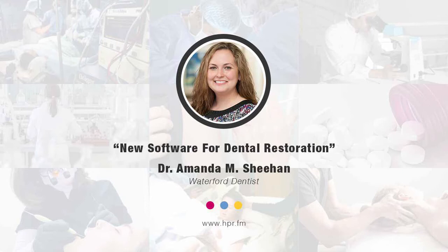Sure, there was a lot of blind faith before. Is this something that's absolutely, positively accurate as far as how it's going to look? So the best part about computers is you can copy and paste. So when you say exactly, well, when we do the mock-up, we're trying it over somebody's existing teeth. So if your teeth are small and we're making your teeth larger because that's more appropriate for your face, then yes, it would be exactly like your permanent.